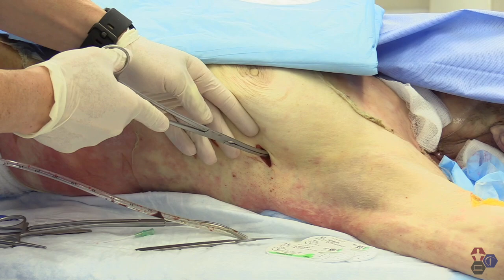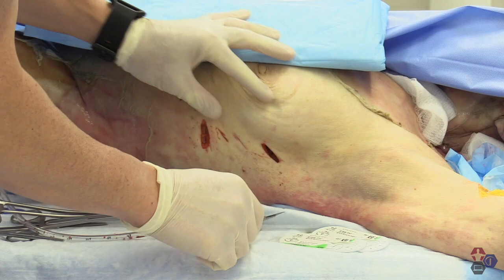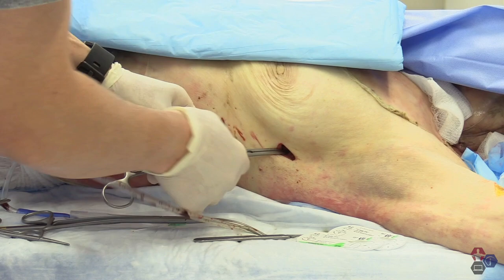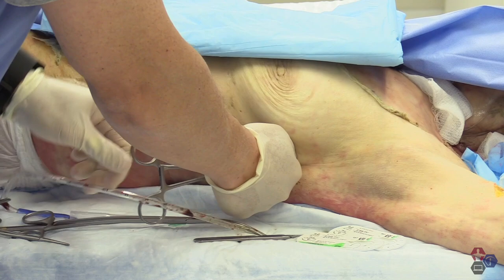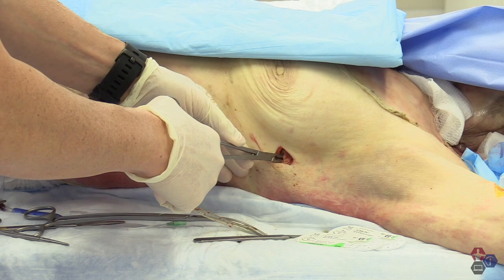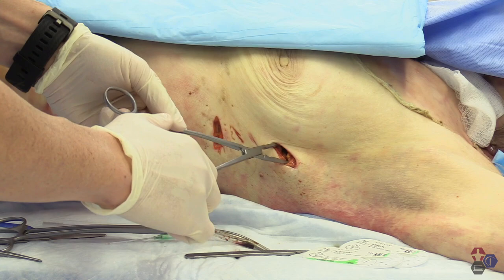Another method is to slowly dissect down with the Kelly clamps until you're at the pleura itself. You can also put your finger inside to feel for the pleural space. Once you feel that you're at the pleural space, hold the Kelly's on top of your index finger and slightly feel for the pleura. You will actually feel or hear a pop sensation when you enter the chest. You don't want to enter too deep with the Kelly's open — instead, slightly back out, then open. From here, you will hear a rush of air or potential fluid coming out of the body cavity.